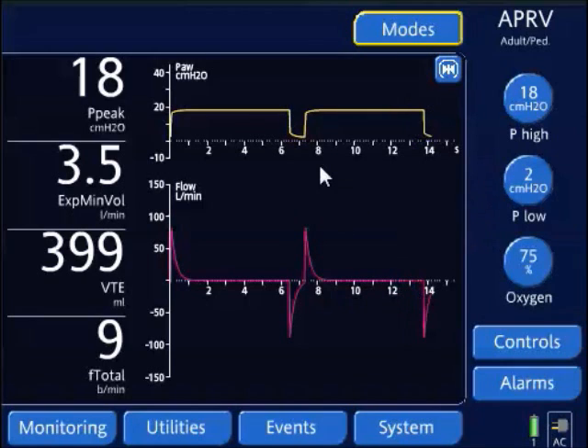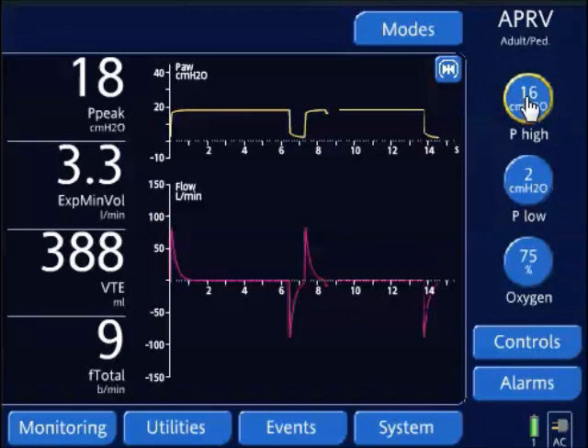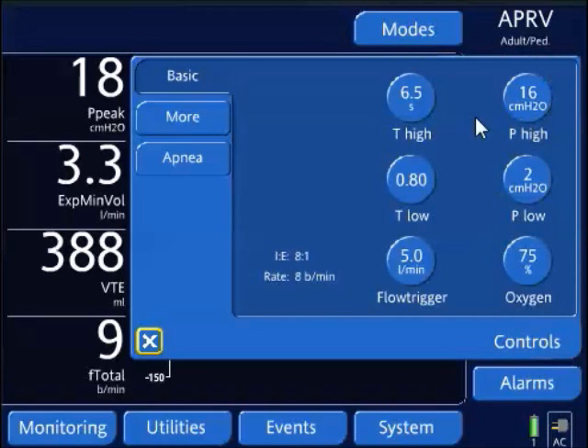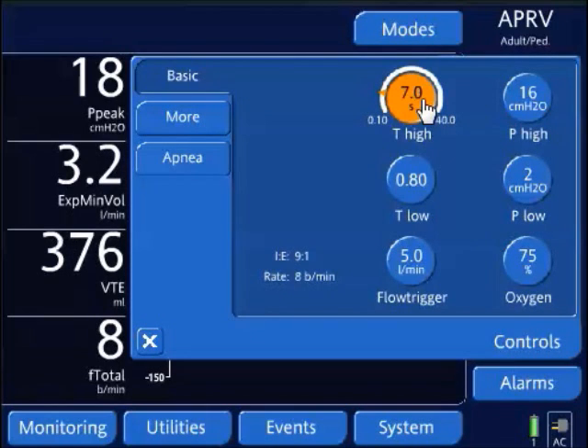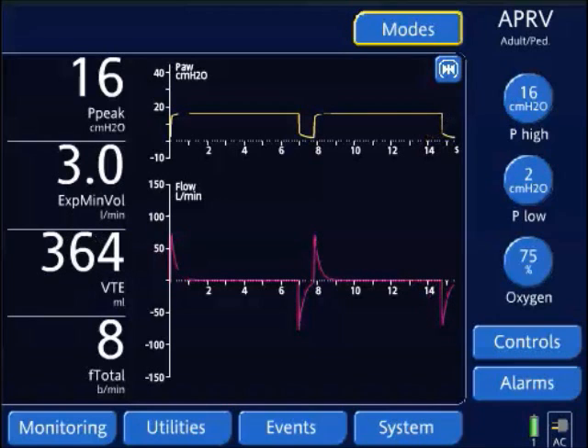I'll constantly re-evaluate the patient. Again, I'm going to decrease my P high in approximately two centimeter water increments and increase my T high setting. This video shows the process at rapid speed — in practice, you'll be doing this over hours or maybe even days, slowly weaning based on the patient's lung mechanics and how stable they're getting.